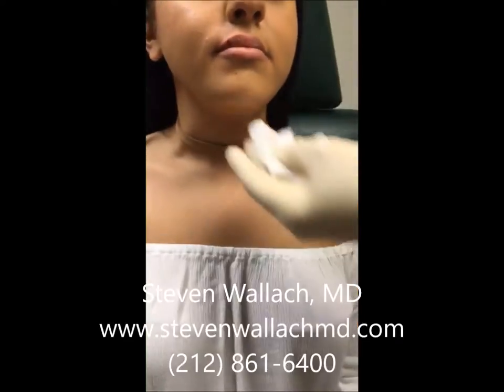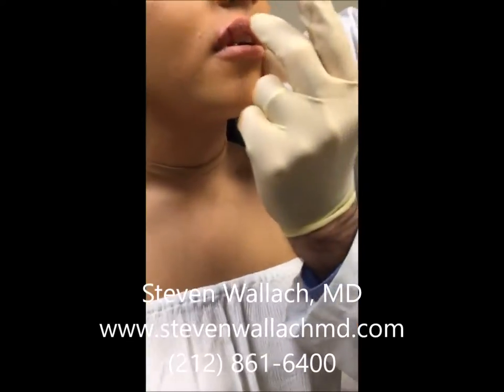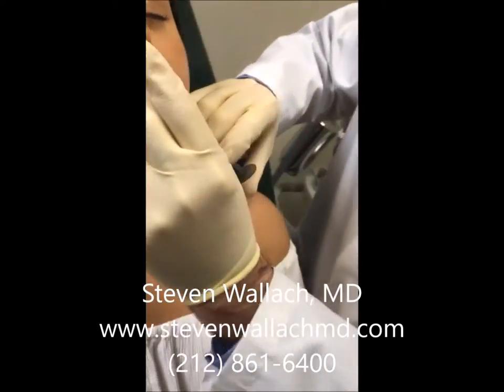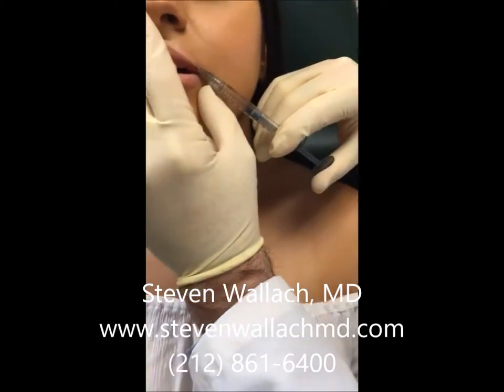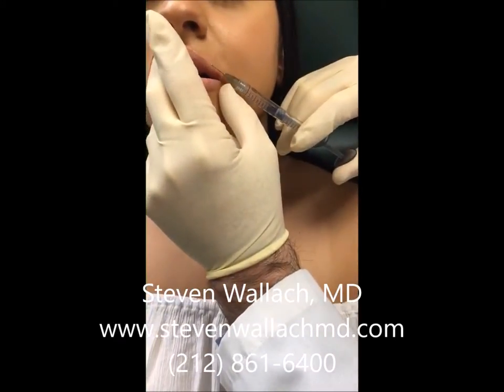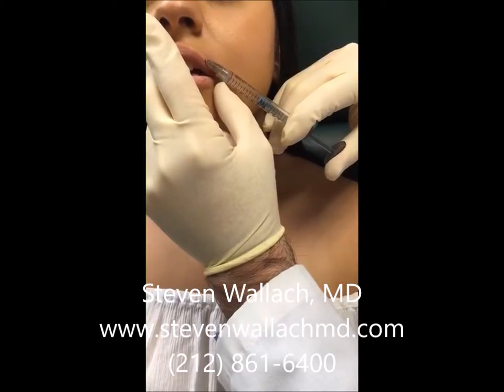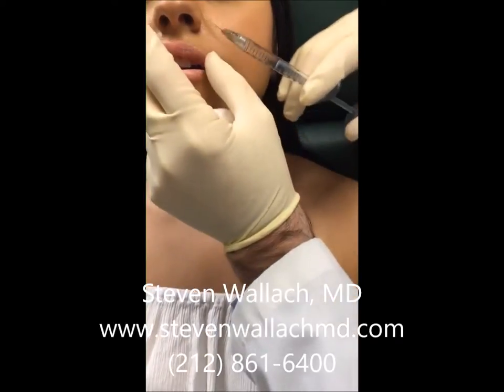Then I go to the other side and do the same thing and serially inject the material. I have used other fillers like Perlane, which is now called Restylane Lift, and Restylane, as well as the Juvederm Ultra and Ultra Plus products in the lips.